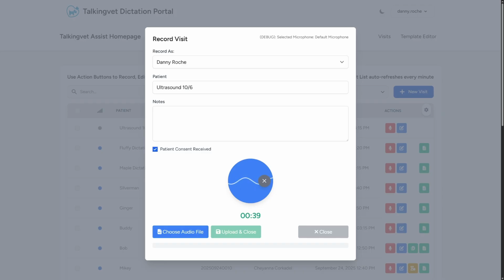Urinary bladder is moderately full, wall looks thin and regular, and there aren't any visible stones or polyps. Both ureteral openings are unremarkable. Checking the kidneys now, left kidney measures about 4.8 centimeters, right is about 5.1. Both have great corticomedullary definition, no dilation or debris in the pelvis. Adrenal glands are easy to find today. The left side is about 4 millimeters thick, right is about 3.5. Both look normal in shape and echogenicity.